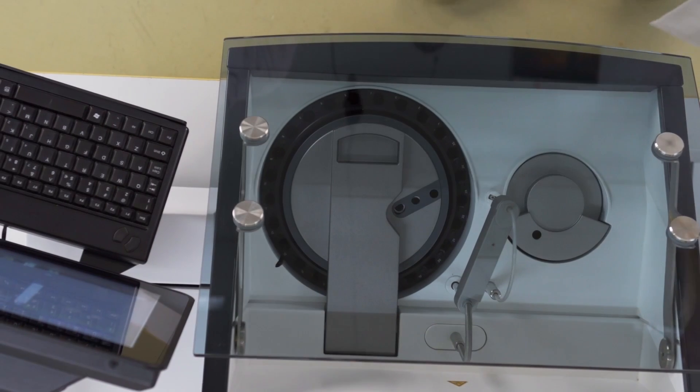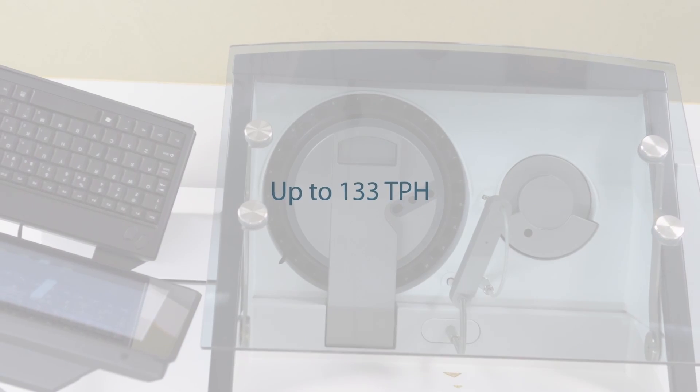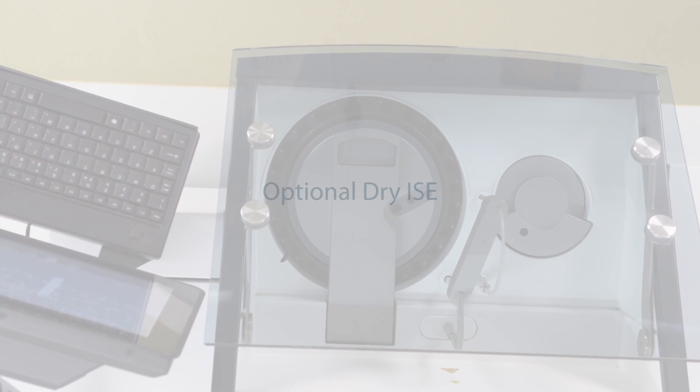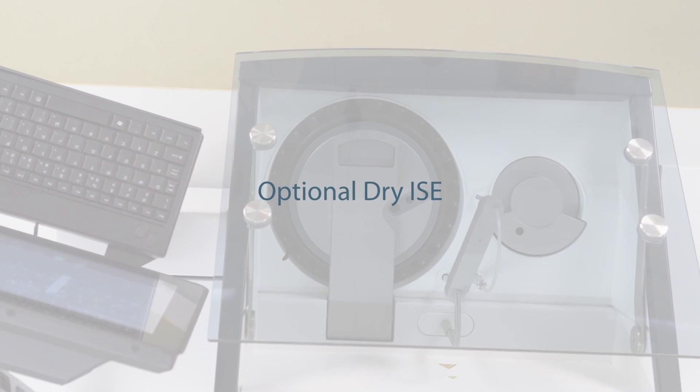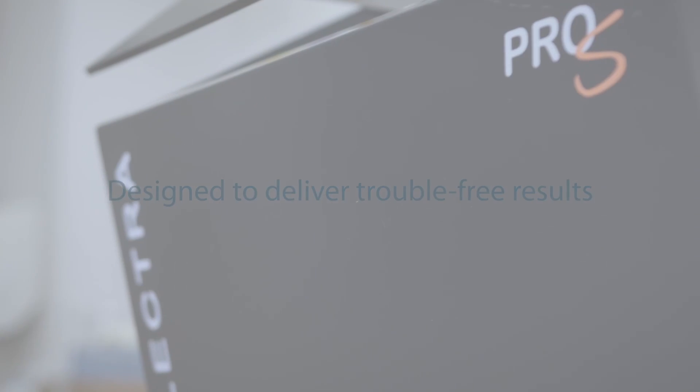The system can typically perform up to 133 tests an hour. The Selectra Pro-S system is designed to deliver trouble-free results that laboratories can trust.